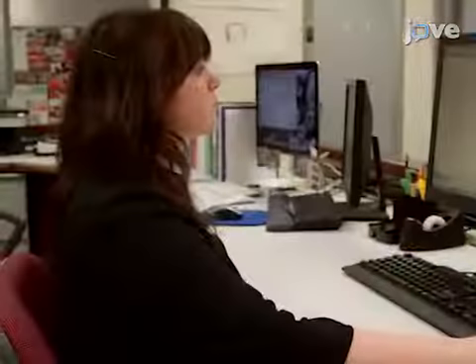Demonstrating this procedure will be Teresa Realpe, who's our head EEG technician, and assisting her will be Jess, another EEG person in the lab.